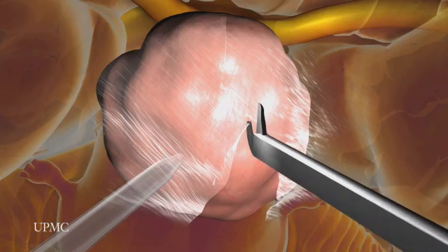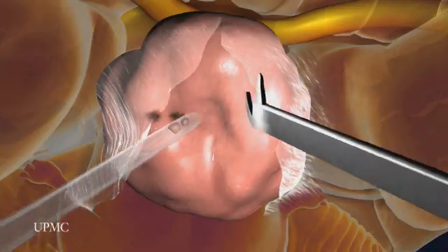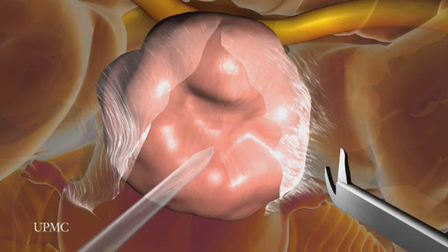Specially designed surgical tools are inserted next to the endoscope to cut through the tumor capsule. In this example, bits of tumor are removed with suction and microscissors until the entire tumor is gone.